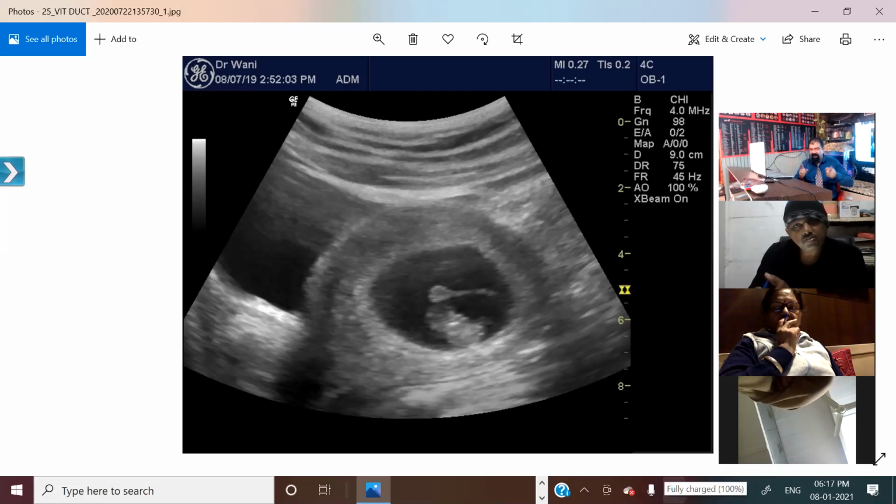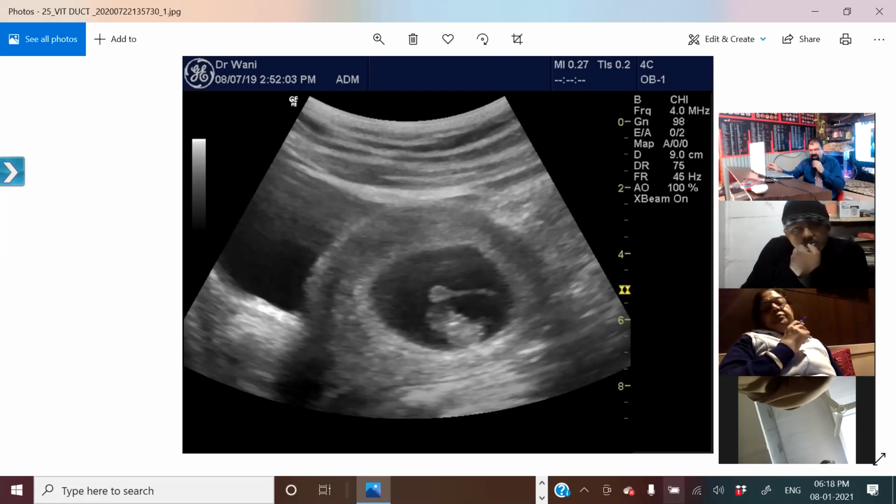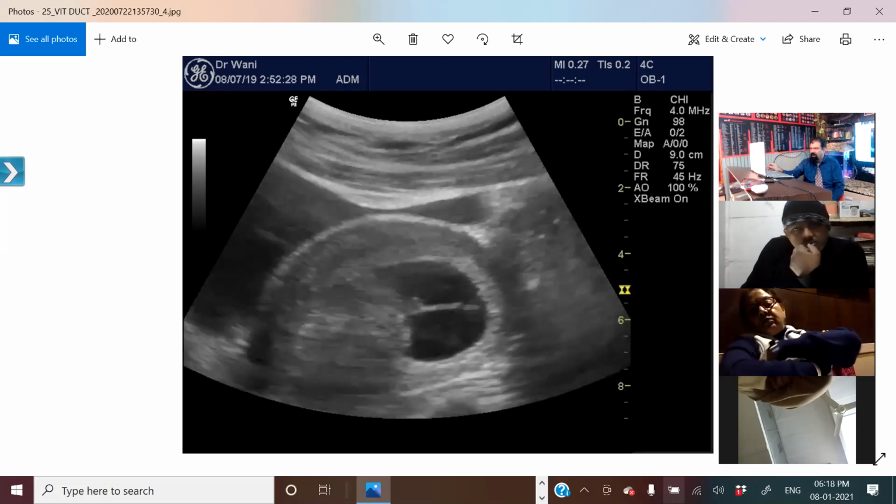If it is deactivated, call us. We will reactivate. Please complete the physics and machine settings before attempting any gynae, fetal, abdominal ultrasound. So this is why we are taking physics and machine settings first. Because first you have to set the machine, then you have to play with these knobs, at least the basic ones.